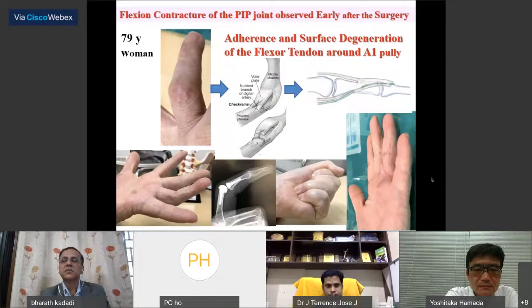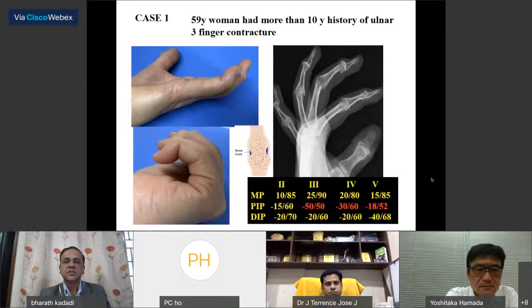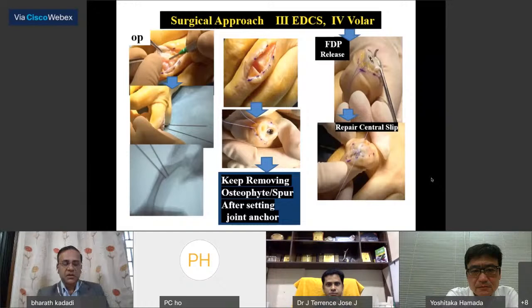I will show some case presentations. This 59-year-old woman had more than 10-year history of stiff ulnar three fingers. Radical removal of osteophyte, extended osteotomy line, flexor tendon release, and the implant setting at loose tension, but not too tight, were important to spread the ROM.